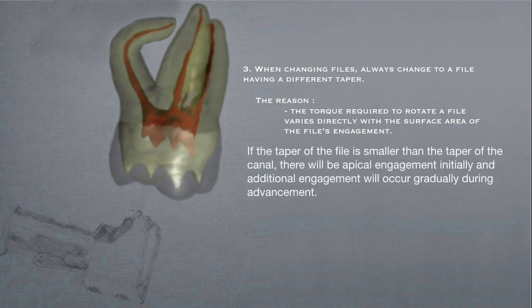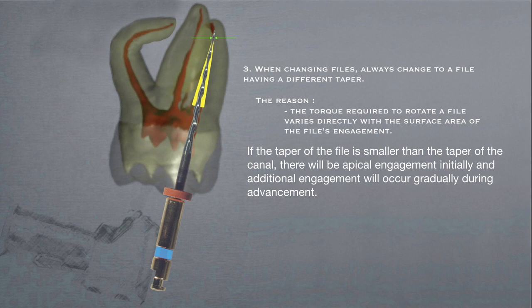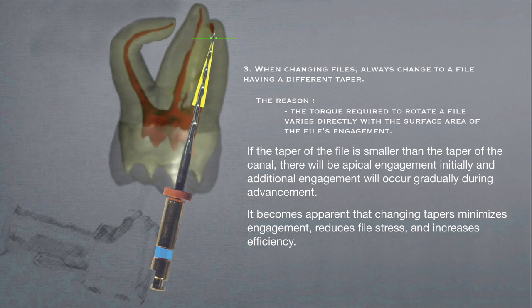If the taper of the file is smaller than the taper of the canal, there will be apical engagement initially, and additional engagement will occur gradually during advancement. It becomes apparent that changing tapers minimizes engagement, reduces file stress, and increases efficiency.